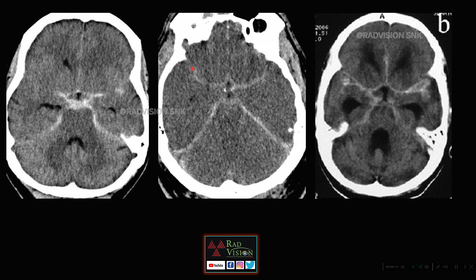The relative hyperdensity along the tentorial leaves, along the falx, and along the sylvian fissures is seen in a case of diffuse cerebral edema or hypoxic-ischemic encephalopathy (HIE). This is a similar imaging appearance but the differential diagnosis is different.